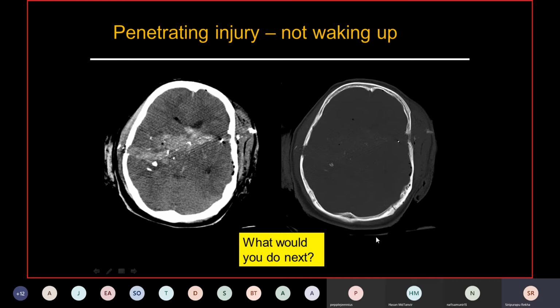Any answers, Tanveer? Yeah, we got one from Dan Lewis. He suggested to do a CTA, and okay. And Sean replied to pray for the chap. Oh, bless him. Right. Okay. Both of you are correct.